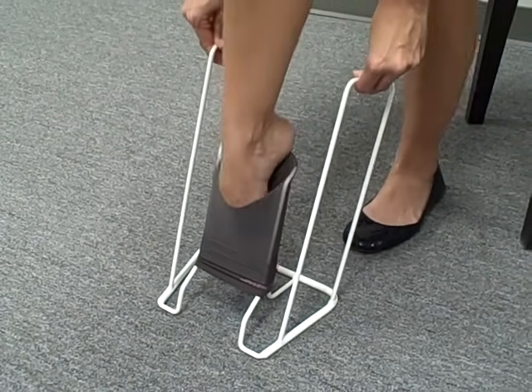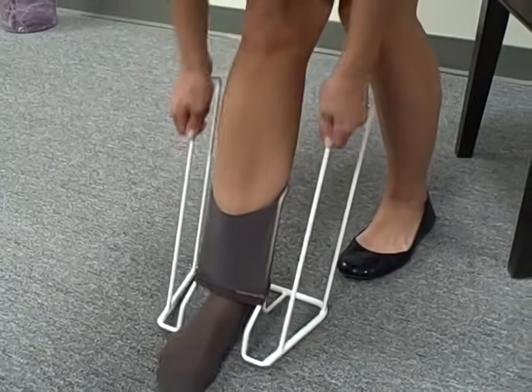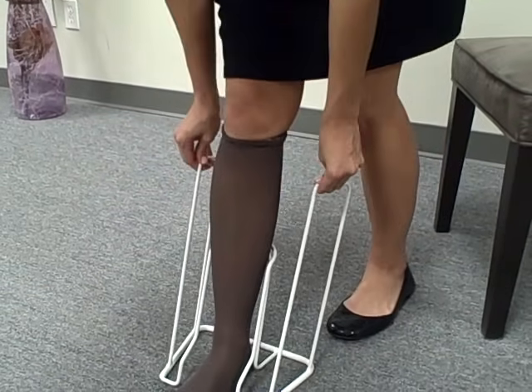Place your foot directly into the stocking and into the butler, step down onto the floor, and pull the stocking up by using the device.